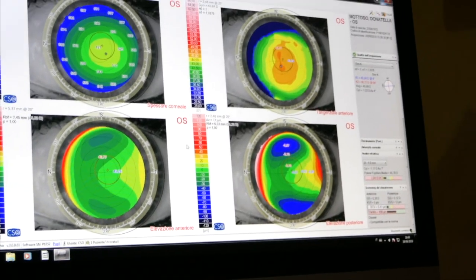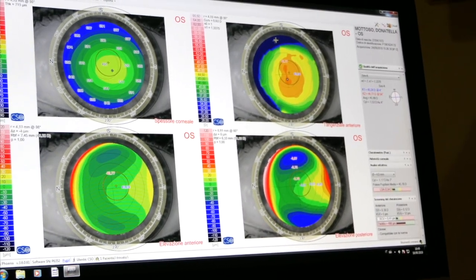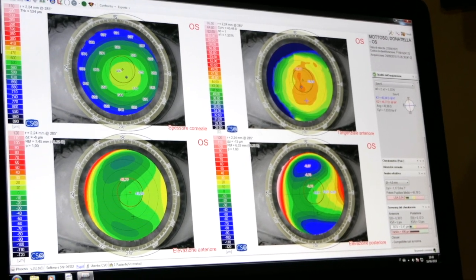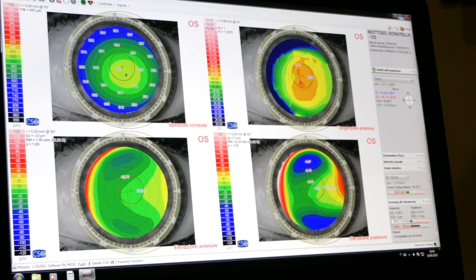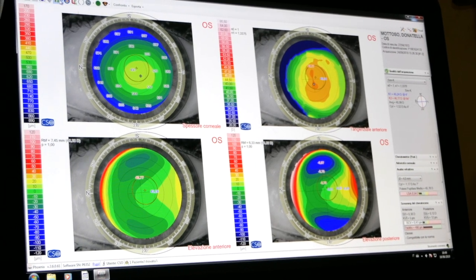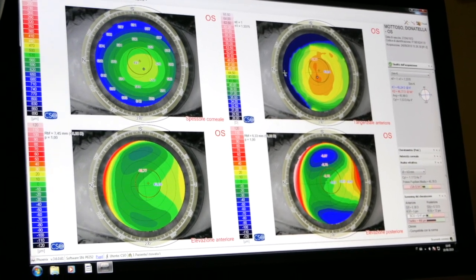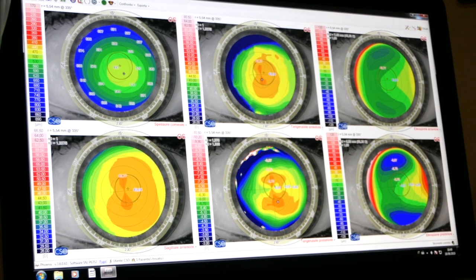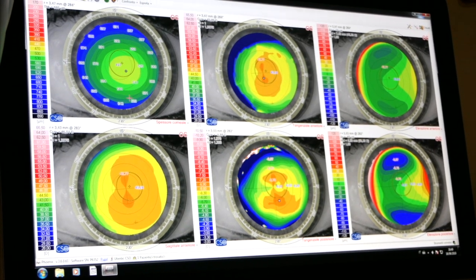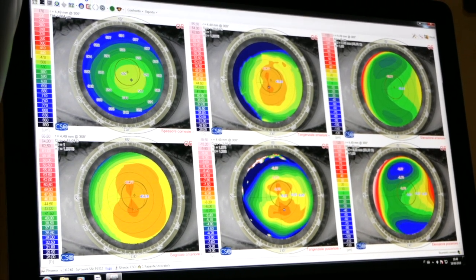Usually, the corneal topography is used with six maps in which the anterior and posterior surfaces of the cornea are represented: corneal thickness, anterior tangent, anterior sagittal, posterior, anterior and posterior refractive elevation, and the space of the anterior chamber.